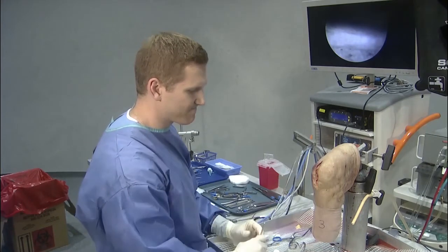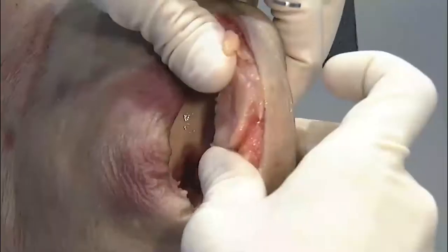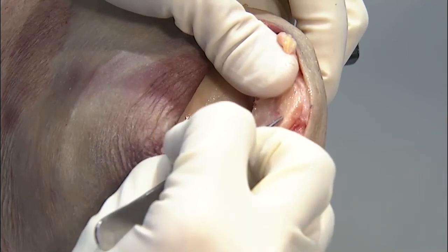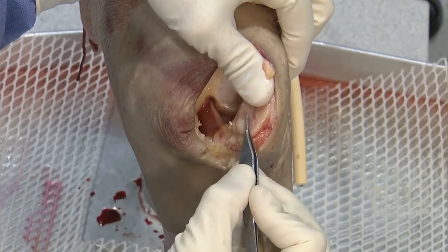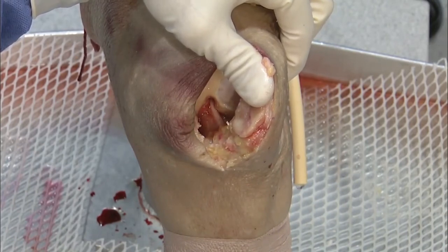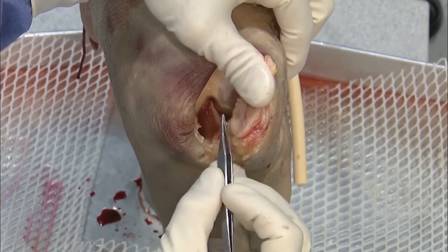And you can see with the gluing, you asked about containment of defects earlier. I've had a few patients with that classic patellar dislocation, they get that classic inferomedial lesion, which is uncontained. Those are very difficult to treat, but typically they have such nice, stable borders above that you can glue in the implant uncontained if you wish. I've done a few of those patients, which I think have turned out fairly well. If you want to add little mini anchors on the edges, you can. I don't think it's necessary. I think the gluing gives me a lot of confidence.